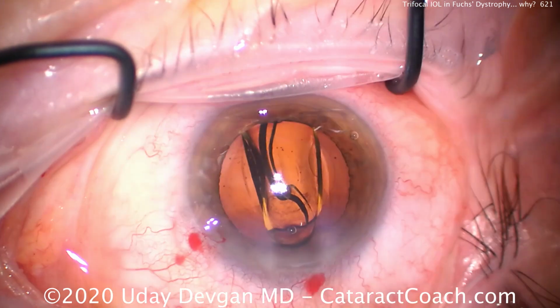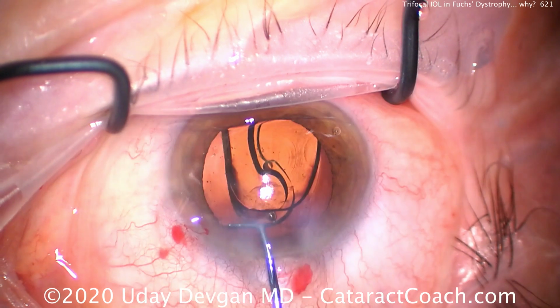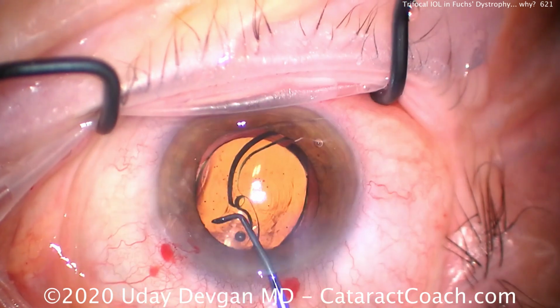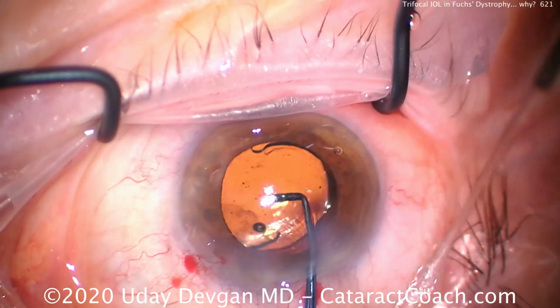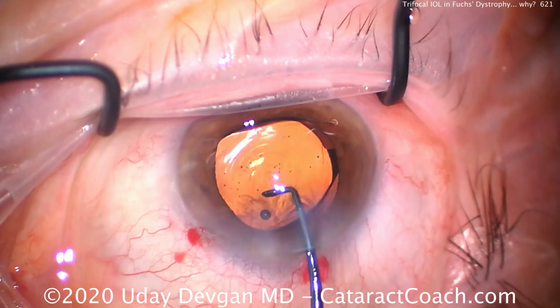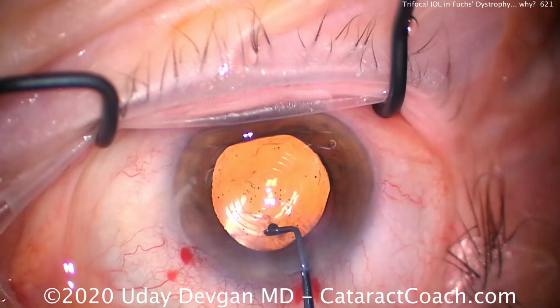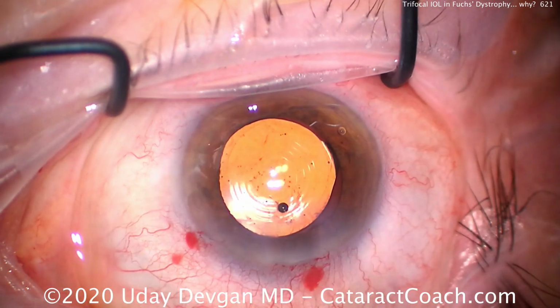So why would I put this lens in this patient? Now, if there was more severe Fuchs dystrophy, I would say for sure put in a monofocal lens. It's the better option. And in fact, even aim for a little bit of post-op myopia in case you have to do a DMEK surgery later, and then you have a refractive shift from that. But in this patient, we're aiming for absolute plano with this trifocal lens.